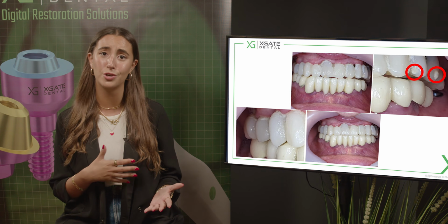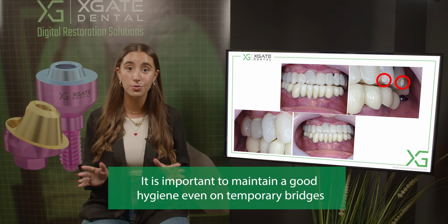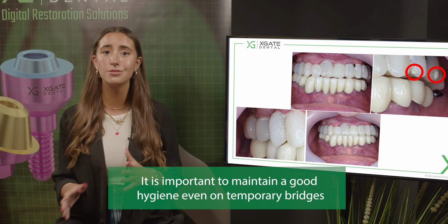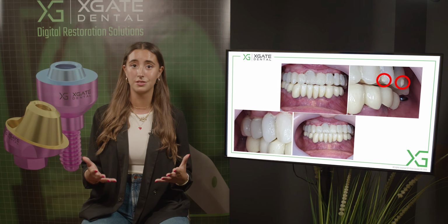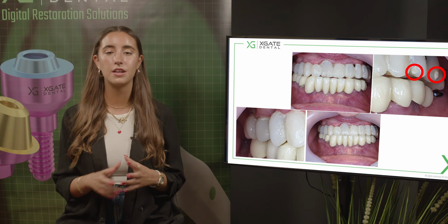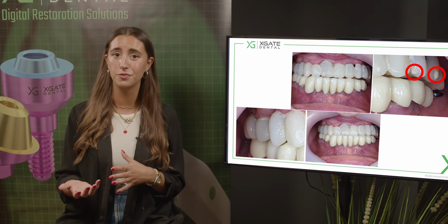You can see the main reason why her teeth were extracted in the first place. You can see that there's no hygiene at all, and you can see all the plaque around the crowns. You can see inflammation around the crowns, and it's not what we want to see after 4 months, after the healing process was done. We want to see clean crowns. Right now, it's not the ideal situation to see after you're sending the patient home and they come back after a few months.